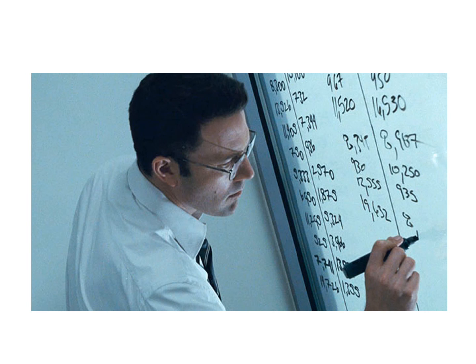Okay, so that's just a whistle-stop tour, but I think the important thing is that we can image and report in a much more efficient way if we try and follow these principles, and we can actually be more useful in our assessments. And it doesn't take long, if need be, to run the calculation. So if you're doing RECIST, for example, and you might be not sure, is it actually progressive or is it stable? For those few cases, you can actually do the maths. You can look at the baseline and the follow-up, get the numbers together, and then you can tell, yes, it's definitely progressed, and that can help.